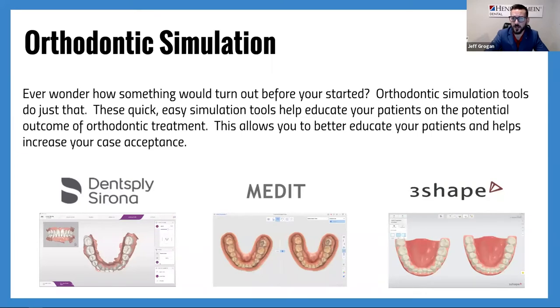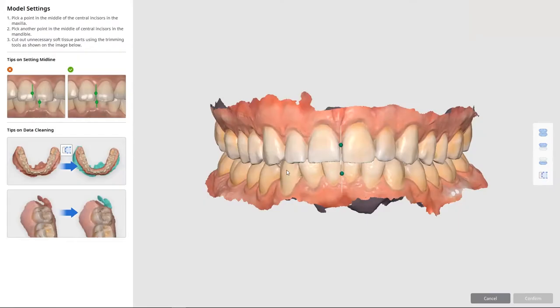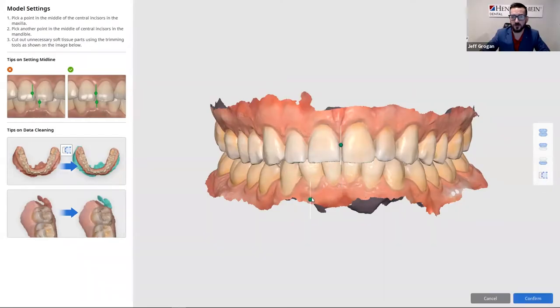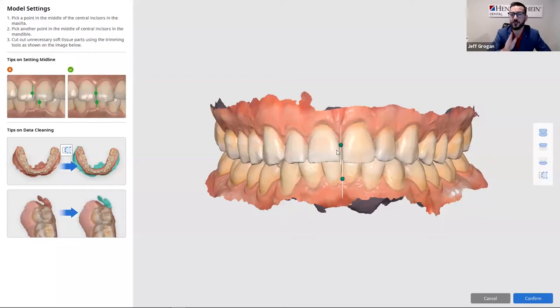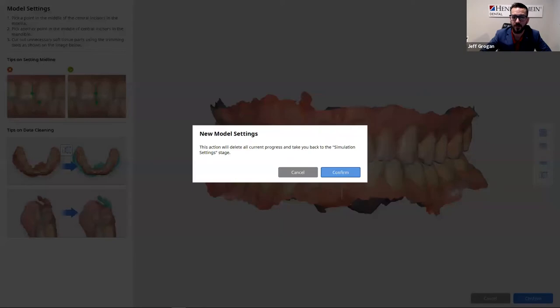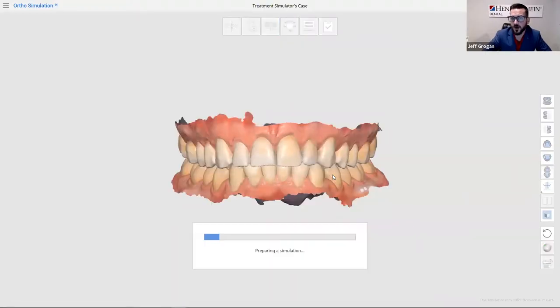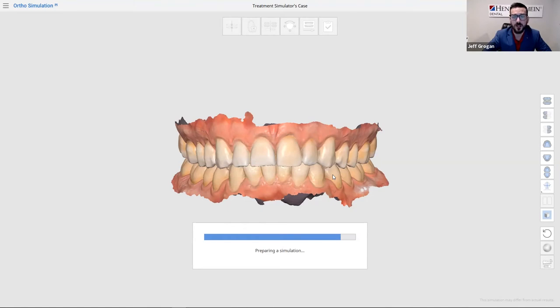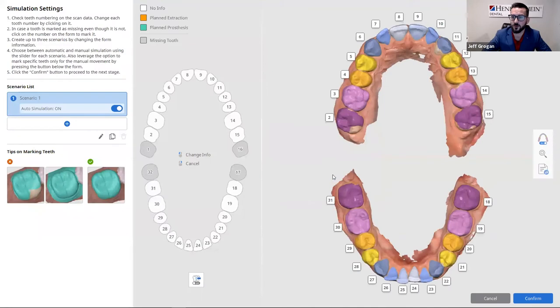Let's jump into Medit software and show what that looks like. Here we are in Medit's ortho simulation software. After the scan, it lets you launch the tool. There are several steps of setup before reaching the analysis and simulation tools. The first step is to set the midlines — upper midline and lower midline — and confirm when done. There's a little processing between each step, so the overall process takes about five to ten minutes when sitting with a patient from start to finish. These are very nice tools that really help advance orthodontic treatment.